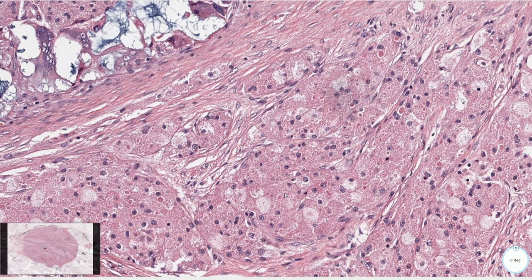The smaller cytoplasmic lysosomes are associated with the finely granular cytoplasm, while these larger lysosomes typically have a halo around them.